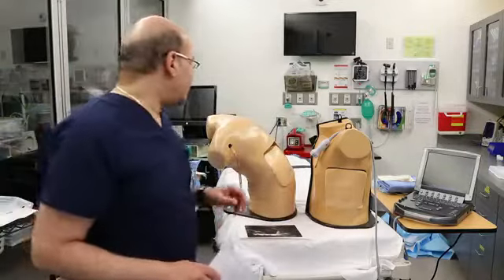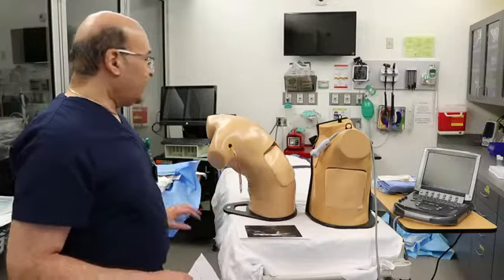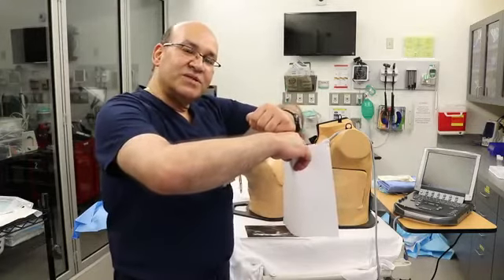Very common position that we prefer to do thoracentesis is like this mannequin. So patient is sitting on the bed with legs down, a table in front of him. He puts his arms on the table and leans a little bit forward. Patient should be comfortable. They may stay in this position for 30 minutes.